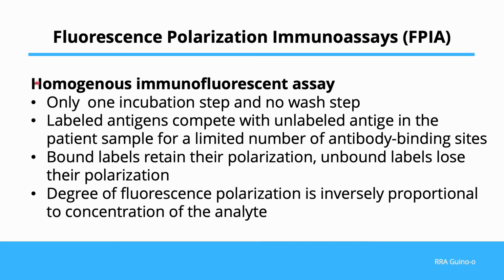This time, we will discuss the Homogeneous Immunofluorescent Assay, known as Fluorescent Polarization Immunoassay, or FPIA. Just like with all homogeneous assays, this test only has one incubation step and no wash step. And it is also a competitive assay, in which labeled antigens compete with unlabeled antigens in the patient sample for a limited number of antibody binding sites.